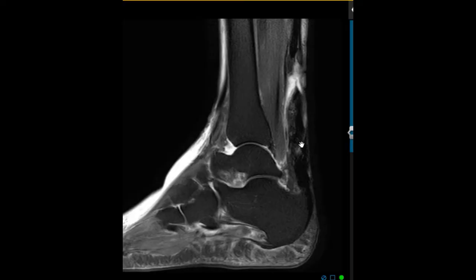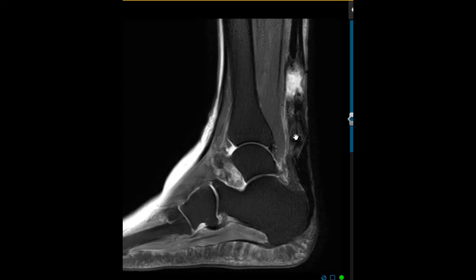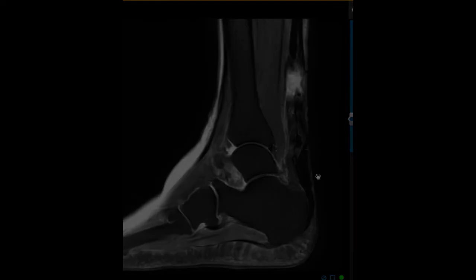And this is the thick distal tendon over here — the redundant end has dropped down, so it becomes thickened. There is also some probably underlying tendinopathy or partial tearing that was present before it ruptured. And that's it — a ruptured Achilles tendon.